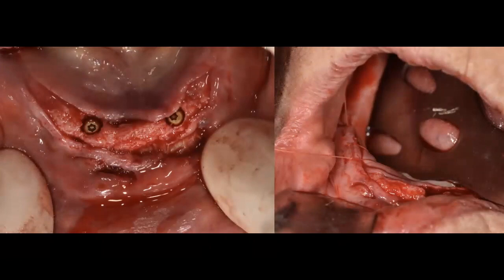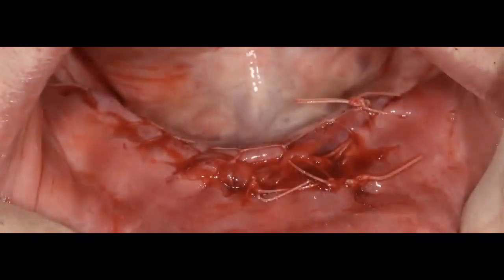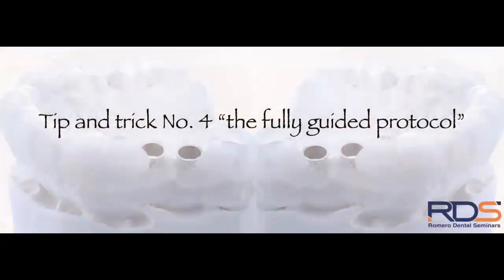At the same time, we can now use our surgical guides to verify not only the location of the implants, meaning that they are located where we initially had planned, but most importantly, that we have a buccal and lingual flange for that denture, so that we're able to pick up our locator attachments when we're ready for that step, after the new denture fabrication. And here are the sutures, and then we just allow for that to heal.